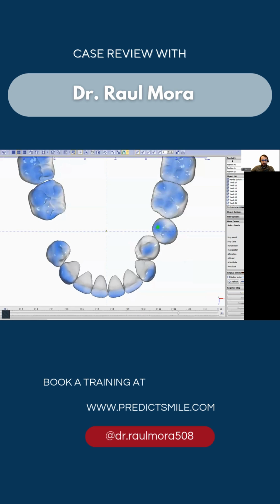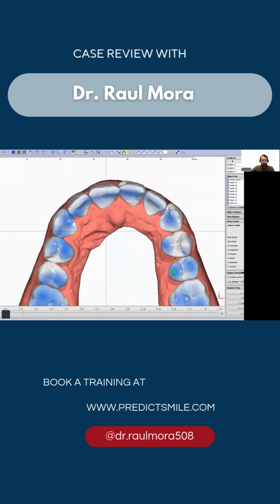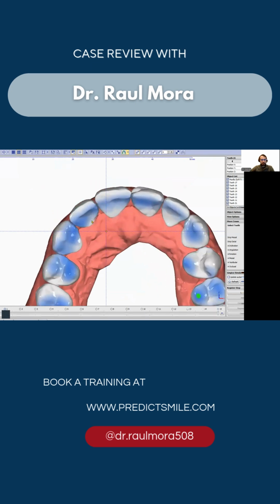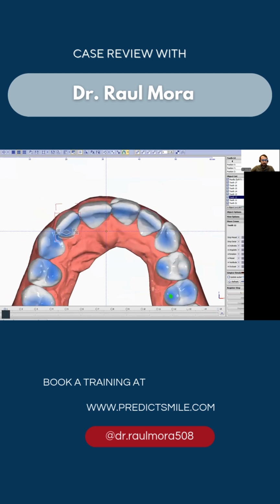So we have this very simple case. So let's finish with the staging. So what are we going to do initially with these lateral incisors? As you can see, it has some rotation, distal out.